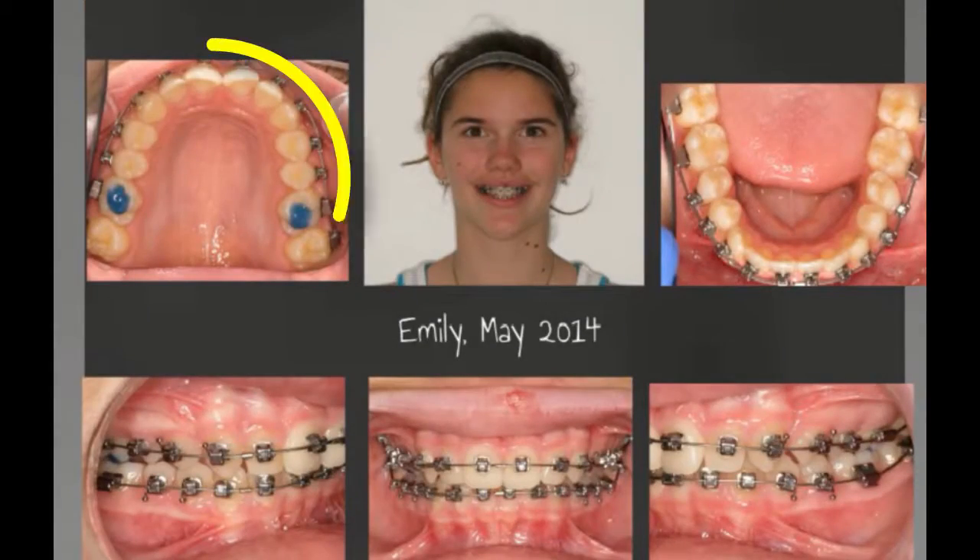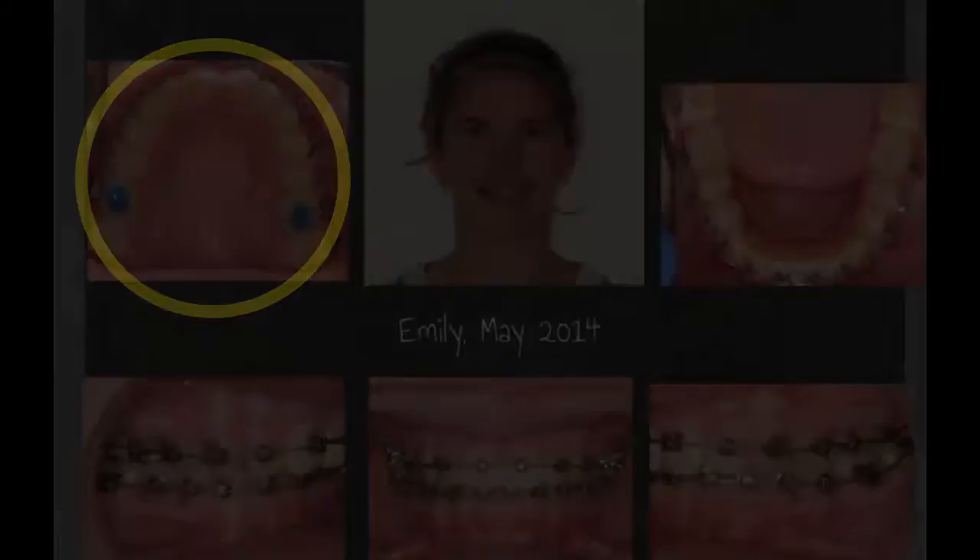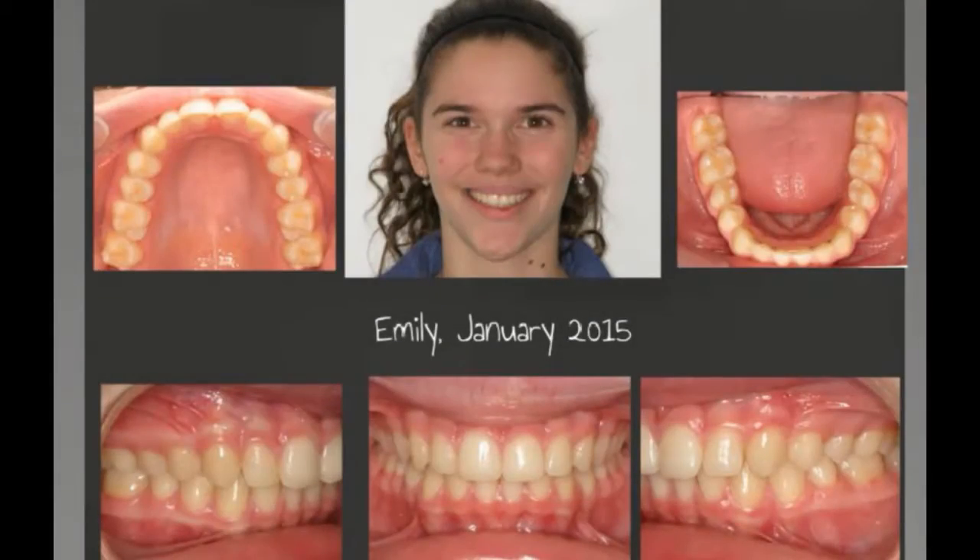Here's Emily. This is the bite block that we use right here to open the bite up, and then using elastics to address her malocclusion and rotate her teeth.